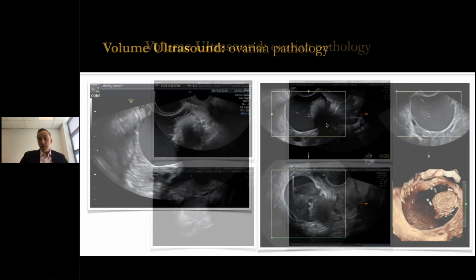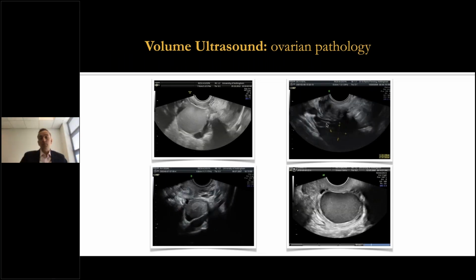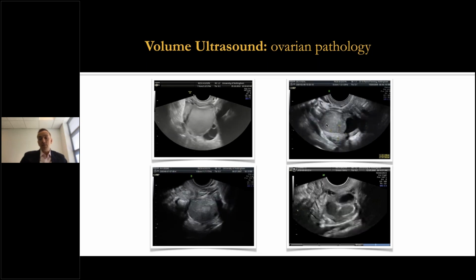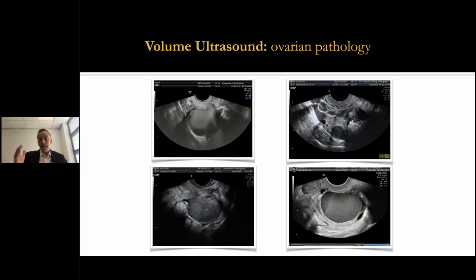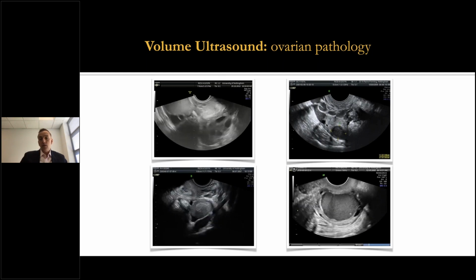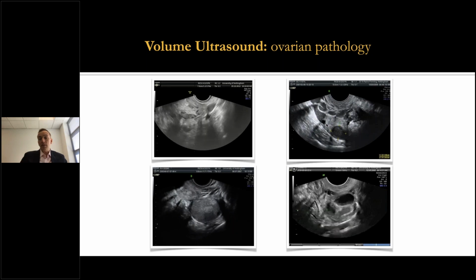Here, a series of endometriomas. And as I said, yes, we talk about ground glass, but I think whatever diagnostic criteria you apply, the use of some basal papillations and so on, it's pretty much a very clear diagnosis to be made. This is an endometrioma. There is no evidence of hemorrhage here at all. So the key here again, there's no evidence endometriomas have a detrimental effect on conception.